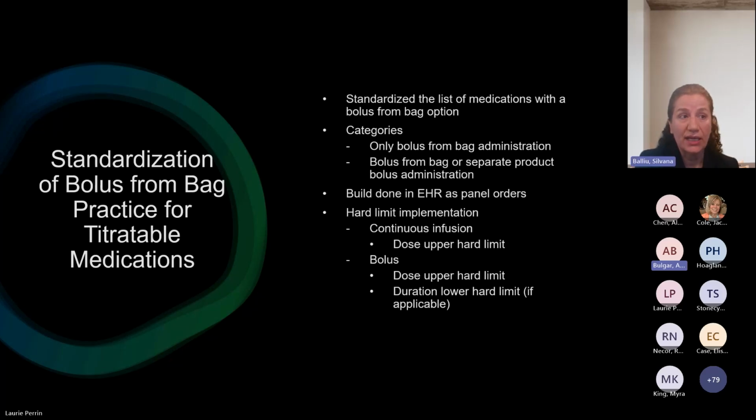Again, this was done to support every patient scenario. If the patient had no IV lines, to minimize the risk of rapid administration of any other medication running concurrently with the bolus med, we limit that to the fluids only.